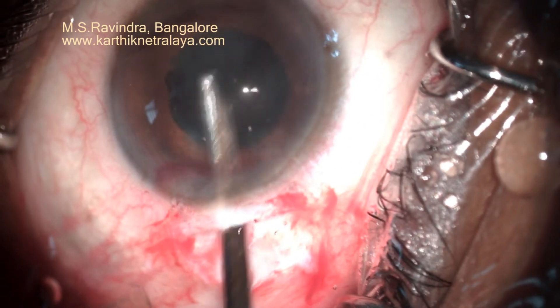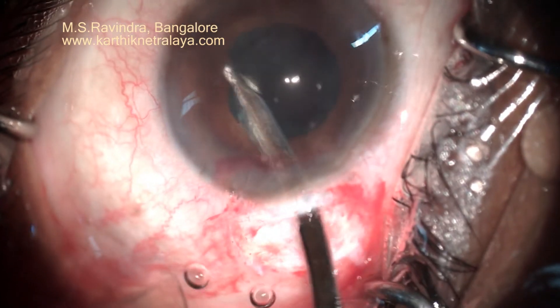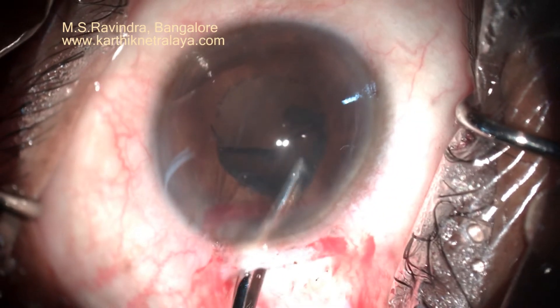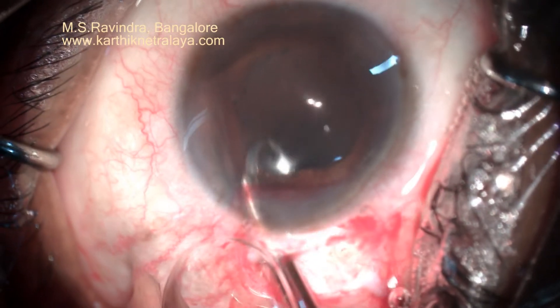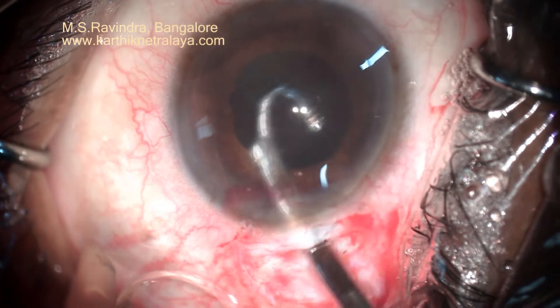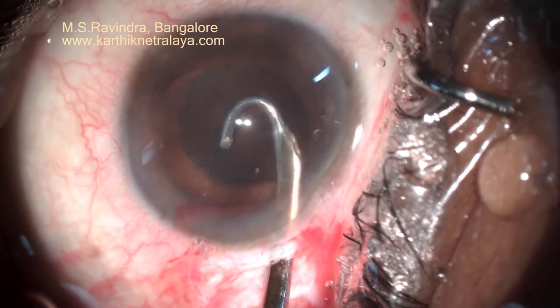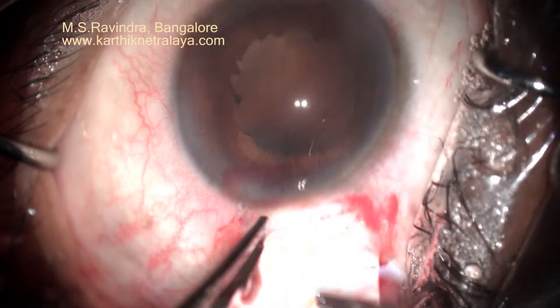In cases with iritis, it is extremely important to remove every bit of cortex from the capsular bag and search every nook and corner in a systematic way so that no cortex is left behind. The cortex is antigenic, so you are not supposed to leave even a small amount in these eyes. The sub-incisional cortex is aspirated by right-sided and left-sided J-shaped Simcoe cannulas, and every portion of the equatorial area has to be manually inspected for debris of cortex.